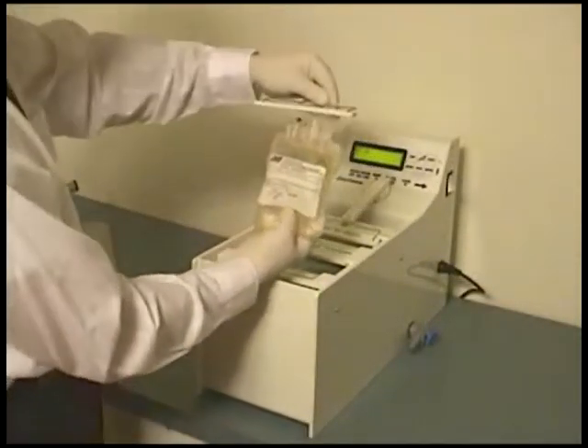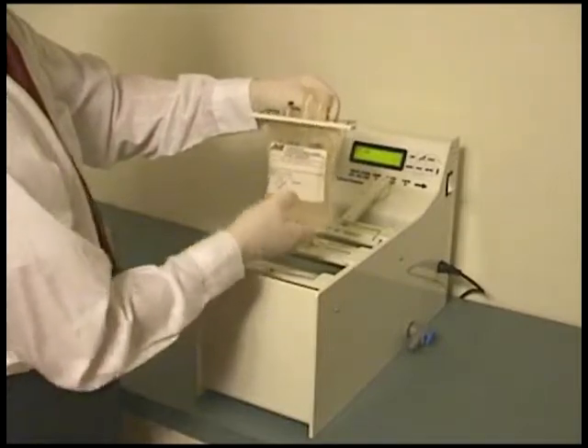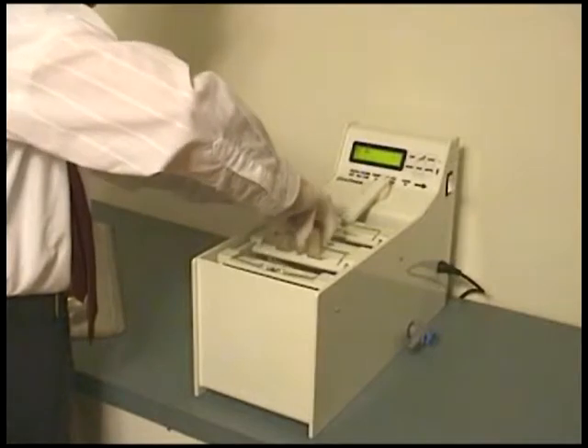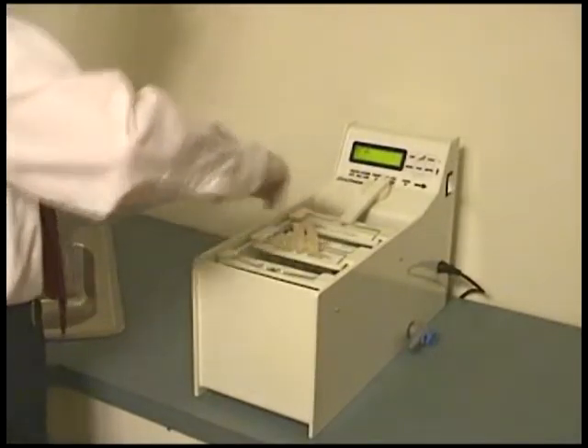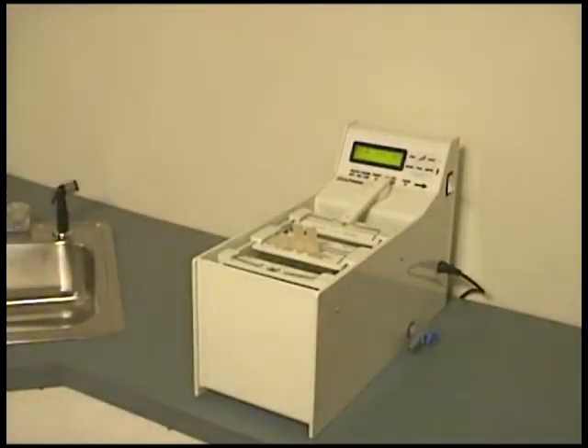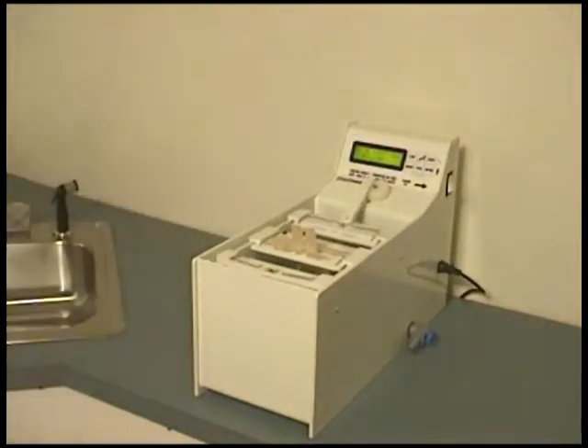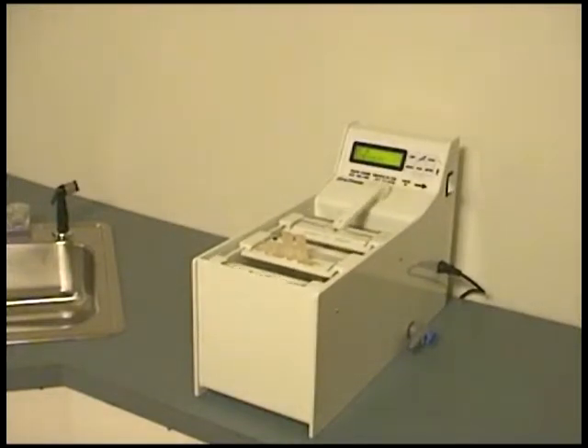The ports of the plasma bags are kept sterile above the water level. Your hands stay dry when loading and unloading the plasma bags. Just hold the clamp over the top of the plasma bag, lower the plasma bag into the water, then pull the spring over the stud. Push Start to thaw for the pre-programmed time.